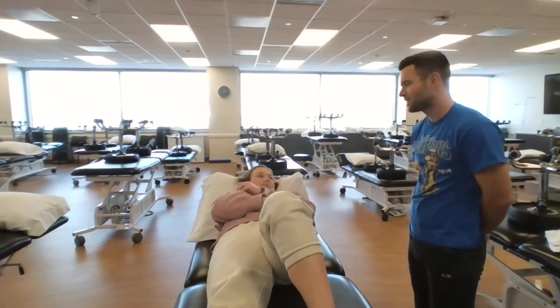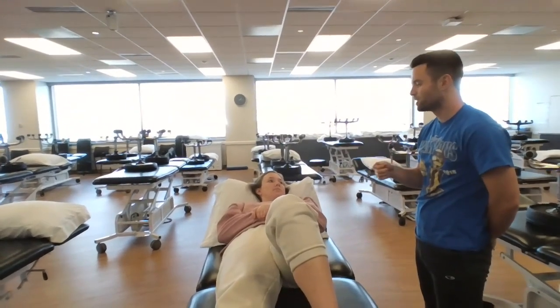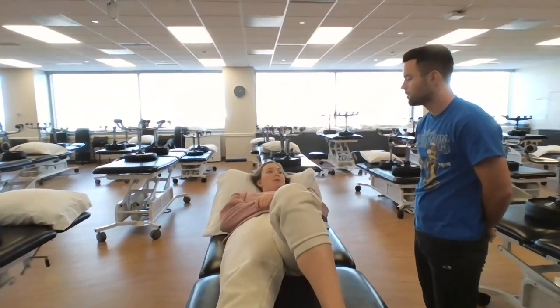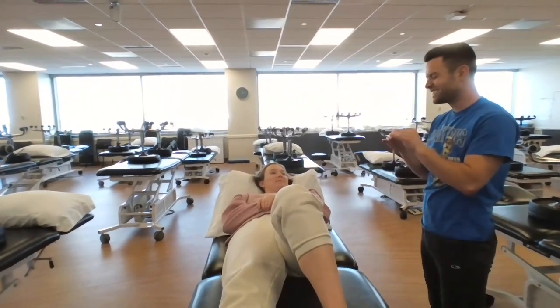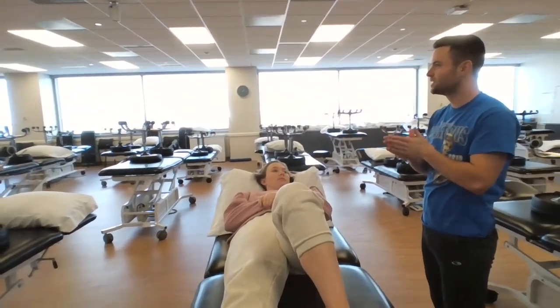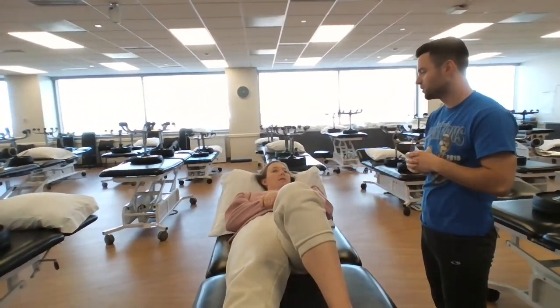Okay. Well, we do something at the clinic called ultrasound therapy. And that kind of helps us get into that tissue and take away some pain that you might be feeling. Have you ever heard of ultrasound before? Only for babies. Okay, yeah. So this is kind of the same thing. We use a machine and we send sound waves into the tissue, and it's not something that should hurt, but it's something that should help that scar tissue, those different tissues to kind of heal and take away some of that pain. Does that sound like something you'd be interested in doing?